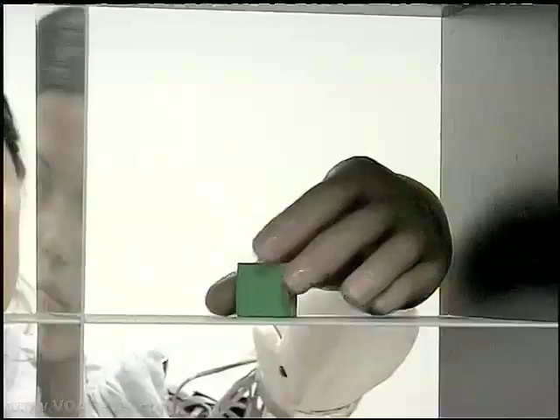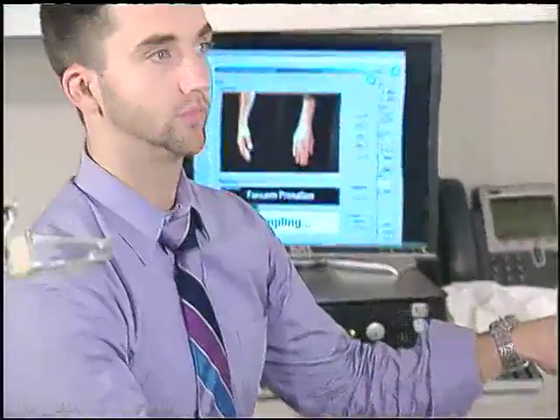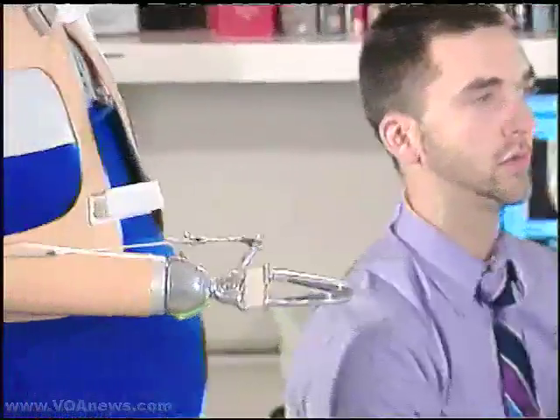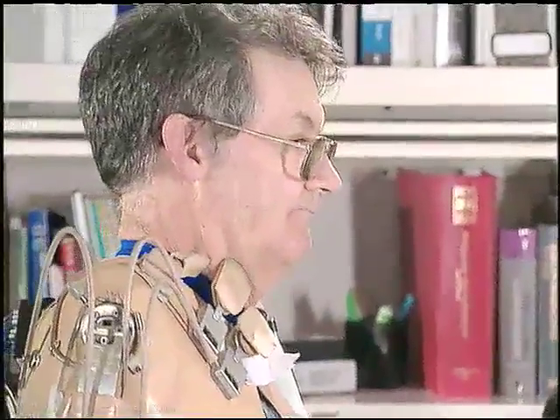Dr. Kuiken has refined the technique and reports patients can now perform a variety of hand, wrist, and elbow movements, a big improvement over the typical prosthetic arm. The patient now doesn't just say 'I want to open and close my hand,' but we're able to control a two degree of freedom wrist with flexion, extension, and rotation, as well as multifunction hands that allow multiple hand grasp patterns.